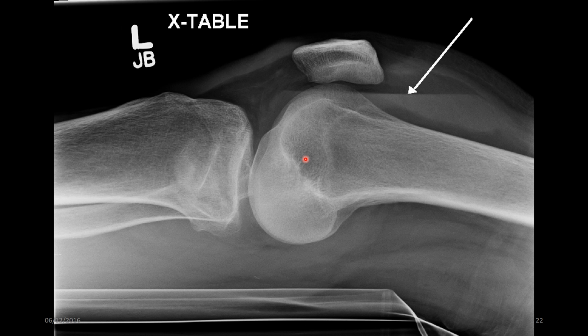So this is a classic one that second-year radiography students will recognise. I think we had to do some sort of project or assignment on lipohemarthrosis. And what that means is a fat fluid interface. That giant white arrow is pointing to the lipohemarthrosis. It's a fat fluid interface because you've got a tibial plateau fracture here. What's happened is blood and fat have come out of the fracture site, because bone has fatty bone marrow inside of it, and also blood because you've injured it. It comes out and creates what's called a fat fluid interface.